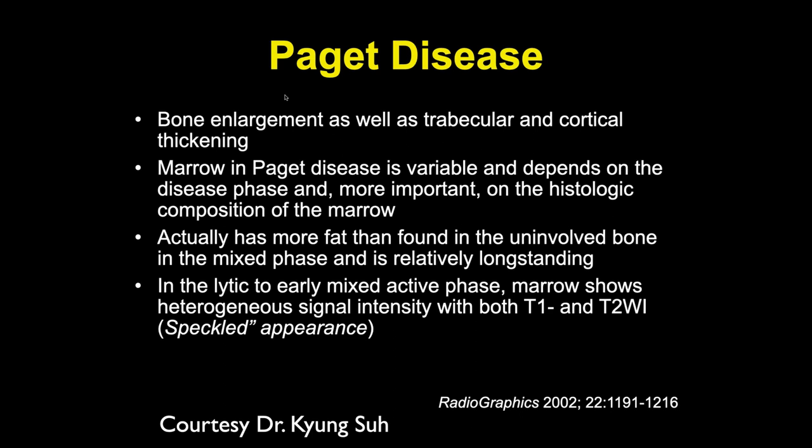By x-rays, you can get the lytic phase, mixed phases, and then sclerotic phases. And with MRI, you can also see variations in signal intensity depending upon whether it's an inflammatory area or a chronic area. And in the end stage, you tend just to get a lot of fat deposition.